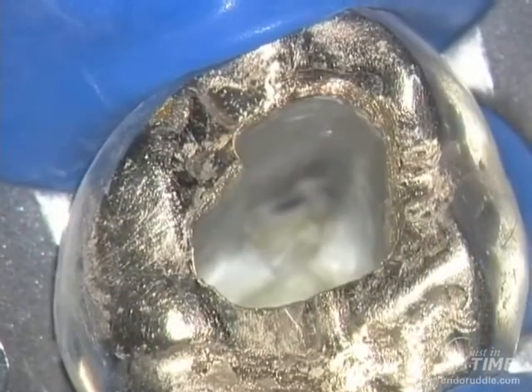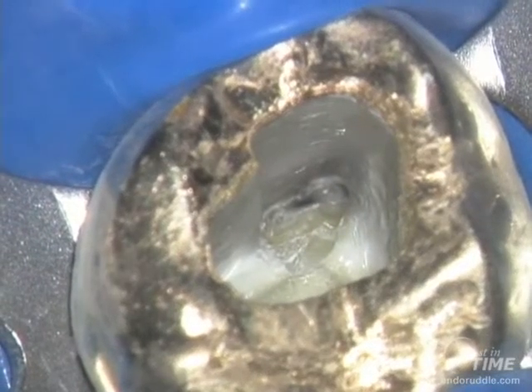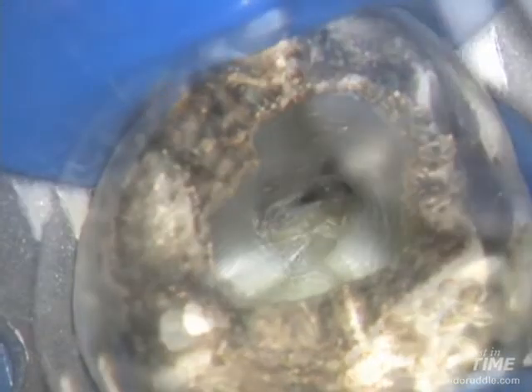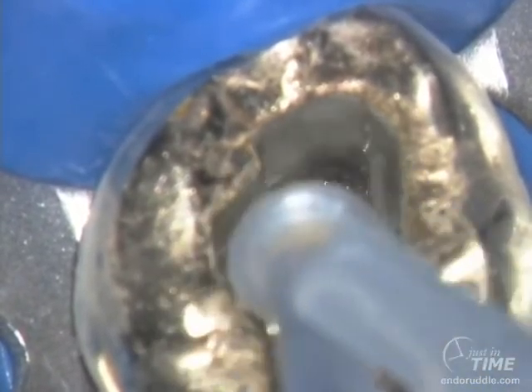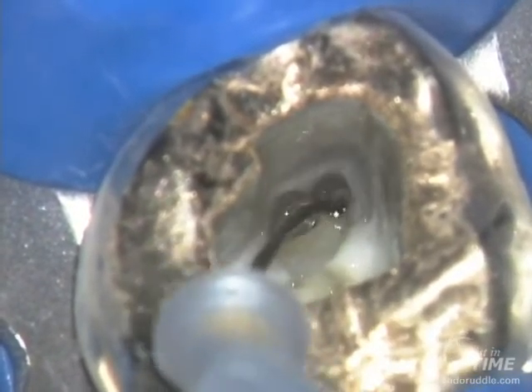Notice the change in the outline pattern from the occlusal view. We can use X-gates or Gates Gliddens to flare the orifice. By removing restrictive dentin, we're able to irrigate better — vacuum and irrigate.